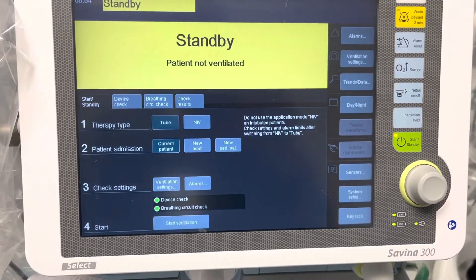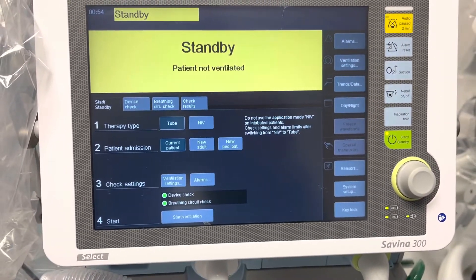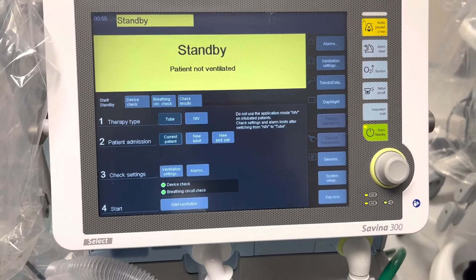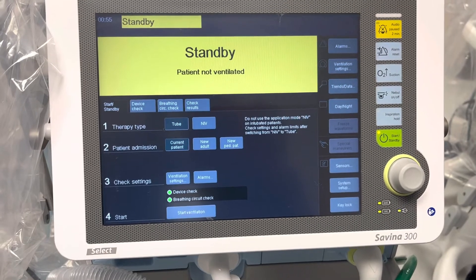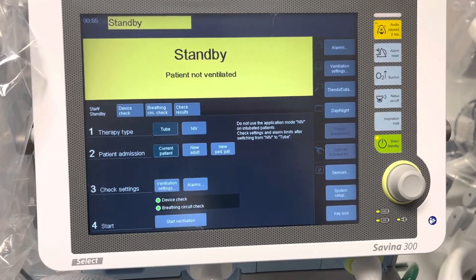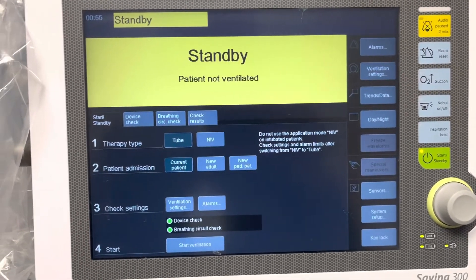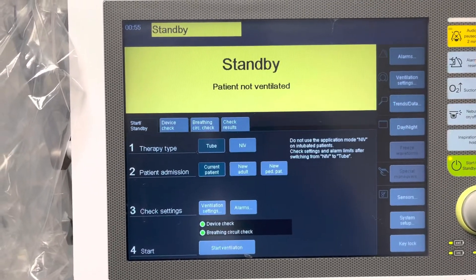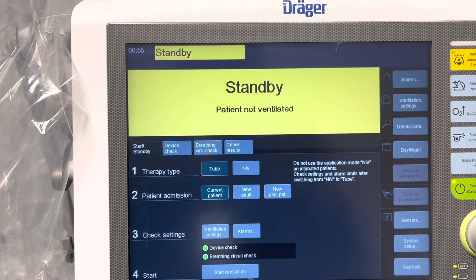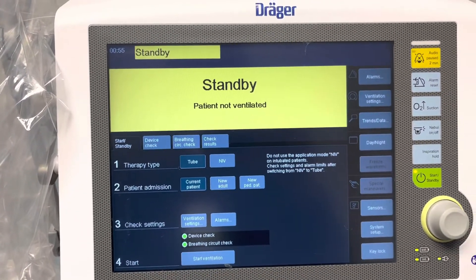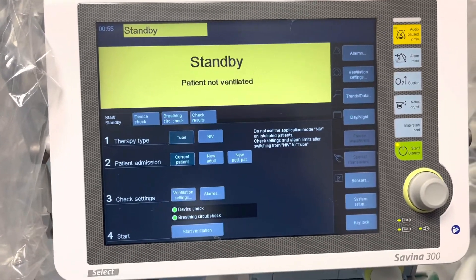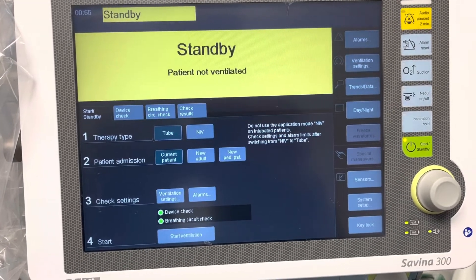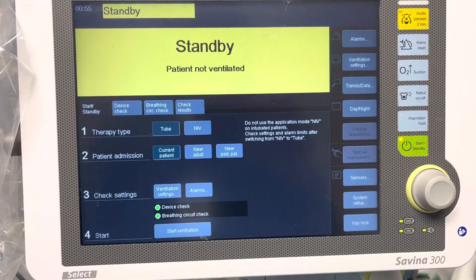Respiratory World. This is just one of the trigger ventilators, the Savina 300. We haven't used it that much here, but we can go over an overview of it.